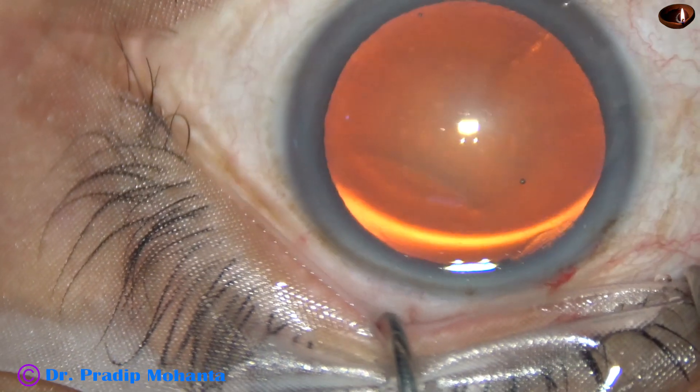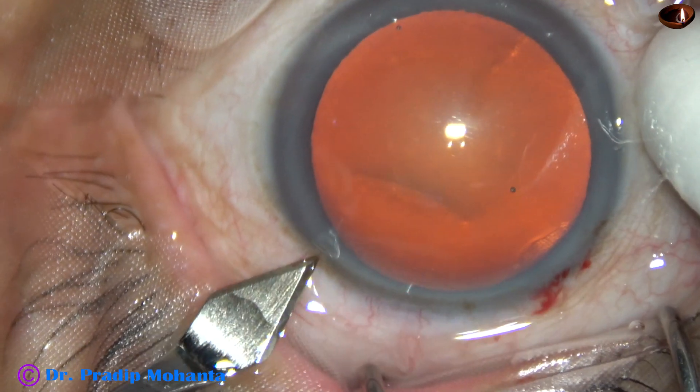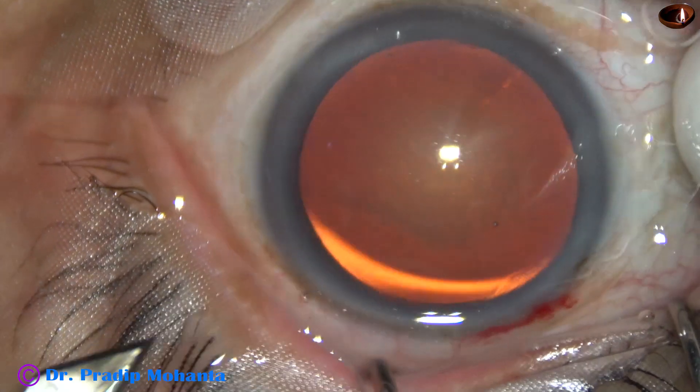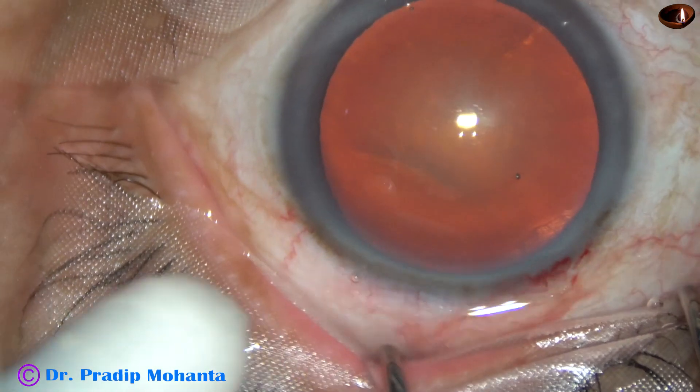The anterior chamber has been filled. Now, by the same keratome, a small side port is made about 2.5 clock hours away.